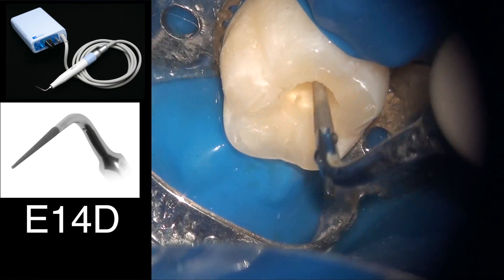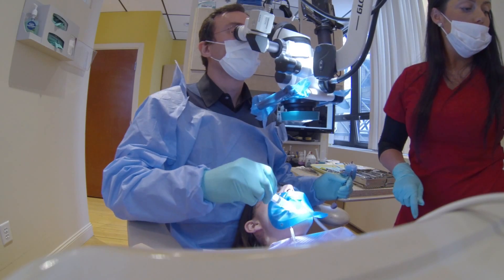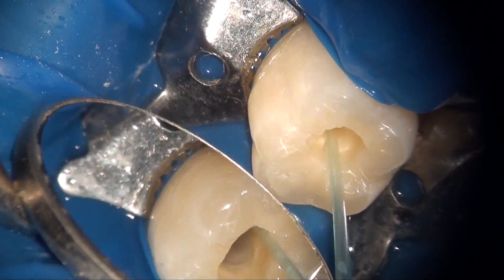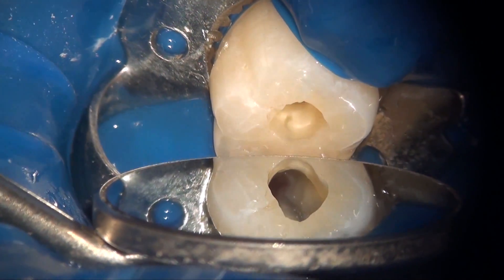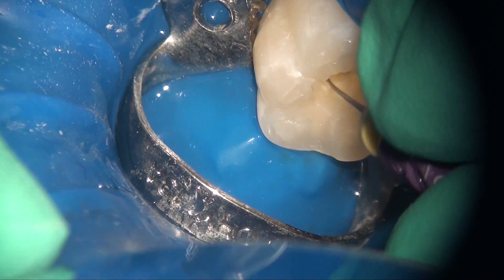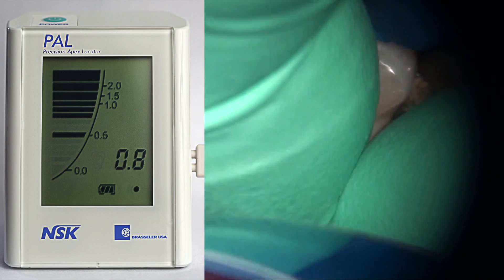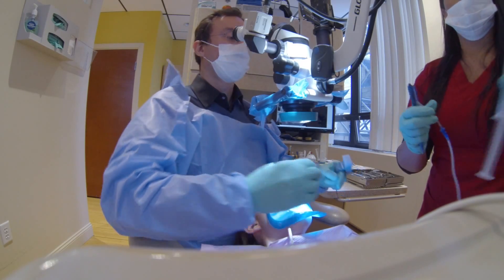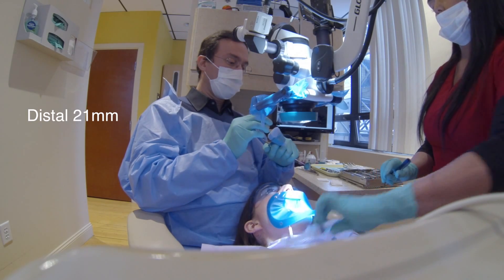Now I'm using the ultrasonic with hypochlorite, and then using the EndoVac macro cannula to suction off any hypochlorite from the chamber — I only want hypochlorite in the canals, not in the chamber. It's time to do our working length measurement. I'm using PAL, which is the Precision Apex Locator also by Brasseler — this is a stock picture, but it gives you the same series of beeps as other apex locators and gives you the length.